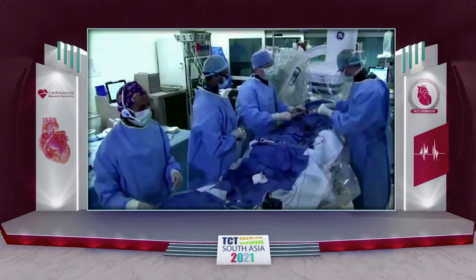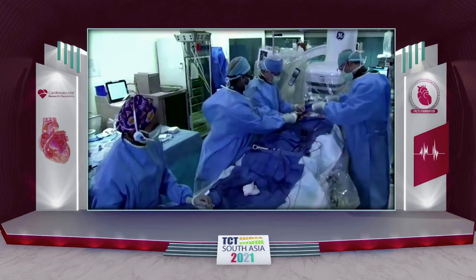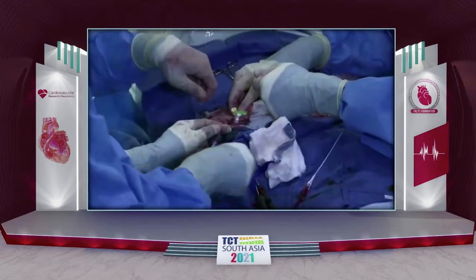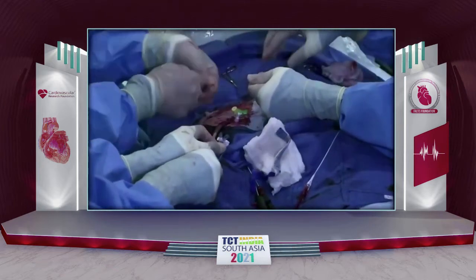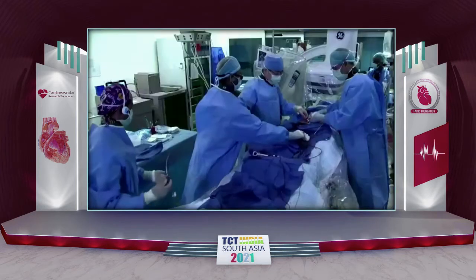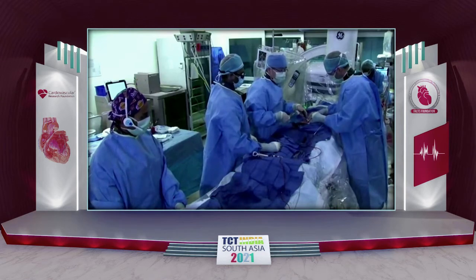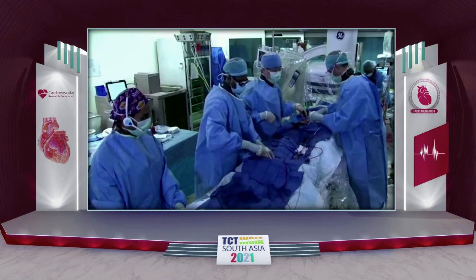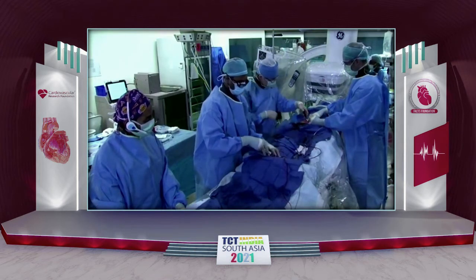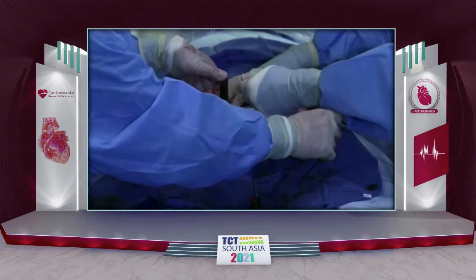I think this is a false kind of dichotomy that's created. Yes, you can save maybe 10, 15, 20 minutes in the room, but in the context of the patient's entire stay, what do you give up for that? In certain patients, a TEE is valuable. In certain patients, maybe it's less valuable. But I wouldn't focus on the TEE. Everybody's focused on the minimalist approach and all that sort of stuff. I think you just make decisions that you think are right for the patient. You can waste 20 minutes on access, you can waste 30 minutes on these sort of things. And I think it's also the anesthesiologist's comfort. If the patient has a difficult body habitus or airway, they would rather get the airway first. But the whole idea that transthoracic is associated with a mortality benefit, in other words, TEE is killing people.